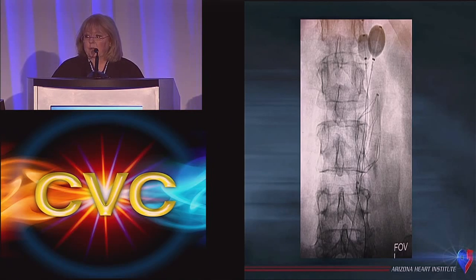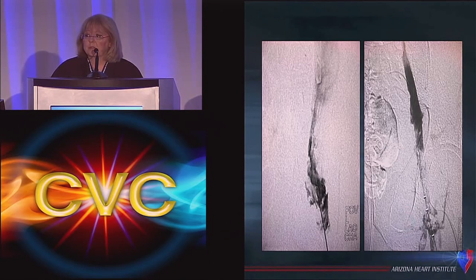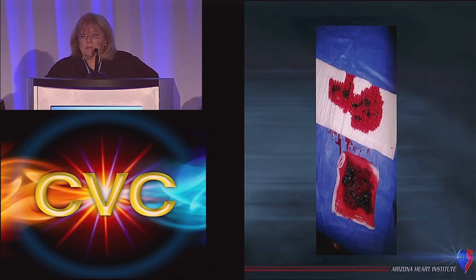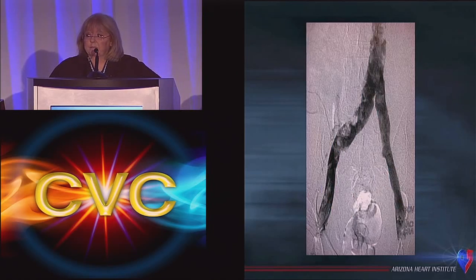I would show you the subsequent results. We got some debulking. It didn't look that great. This is another picture of how much thrombus was left in the filter itself after the trellis. Then we also did a lot of aspiration and got quite a bit out, which is very gratifying. And this was the result after that aspiration. It looked a little bit better.